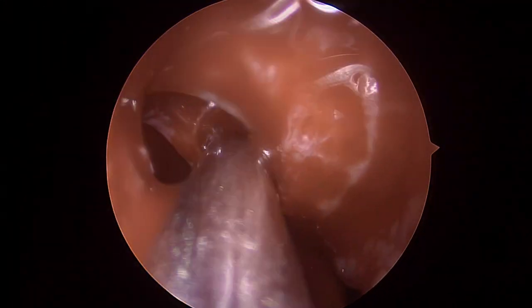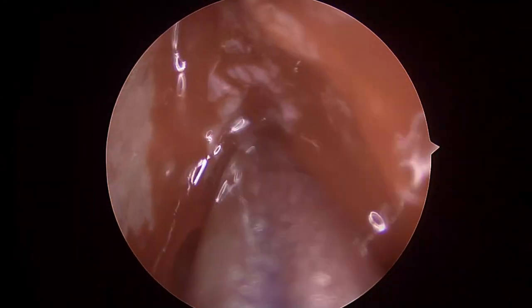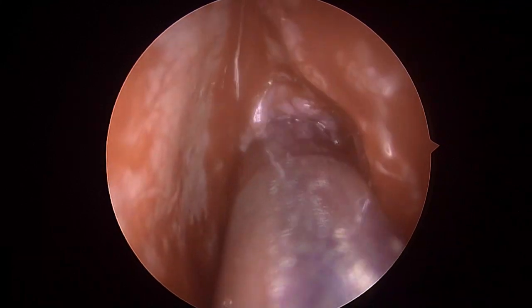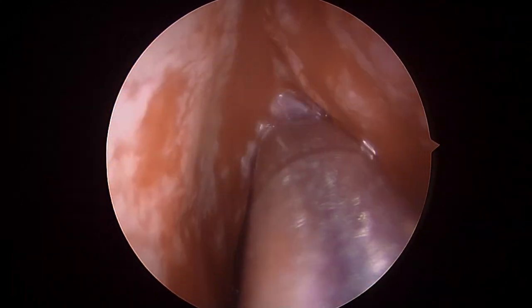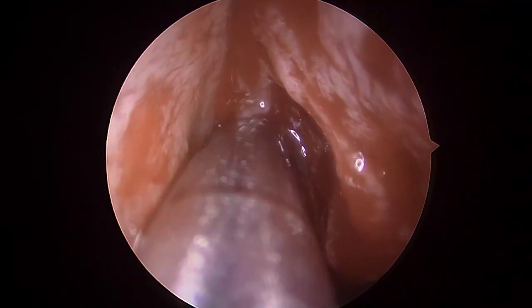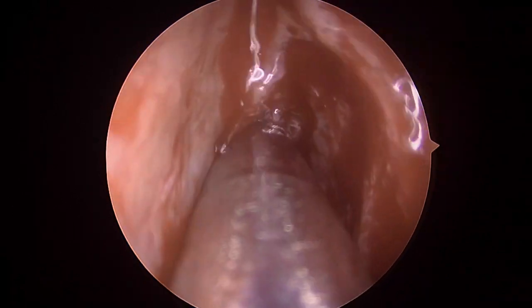And as mentioned before, I am now debriding the posterior limit of the maxillary ostium and opening it wide and debriding the uncinate, but you always ensure that you leave a bit of the uncinate, that is the superior most edge of the uncinate, to guide you towards the frontal sinus outflow tract.